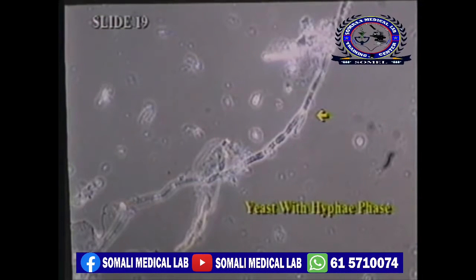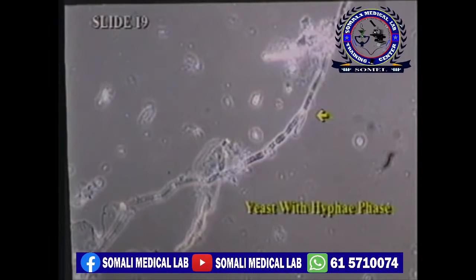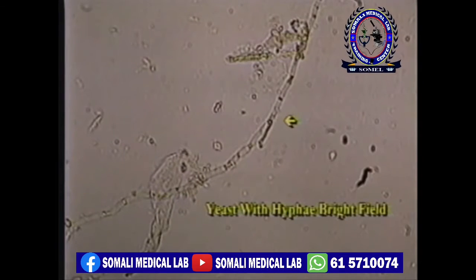Another finding not uncommon when yeast is present is hyphae. Hyphae is a significant finding. This is a phase view. And this is what hyphae looks like under bright field.